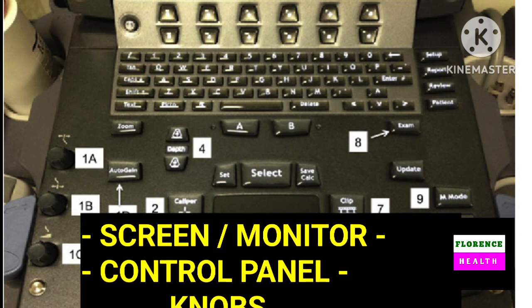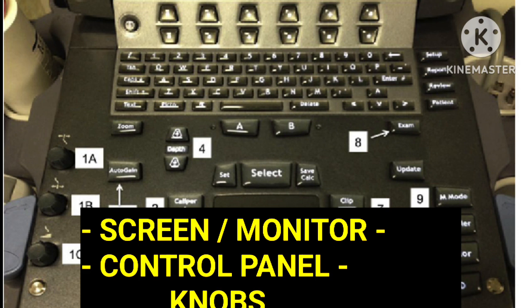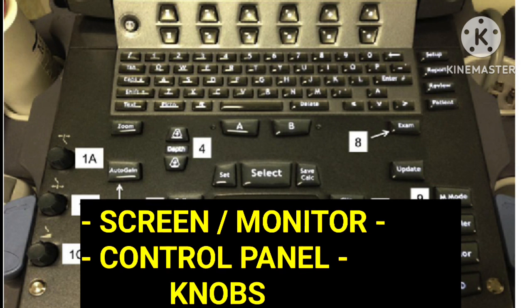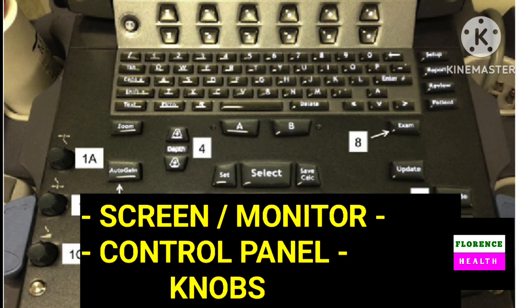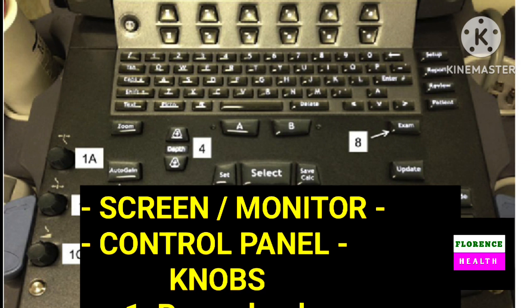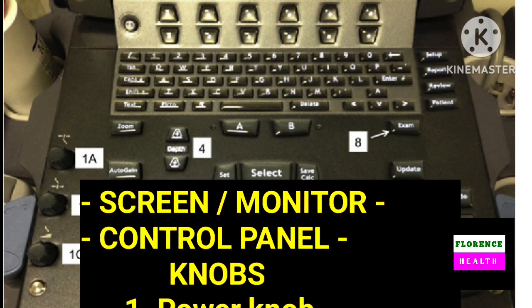First knob is the power knob. It is otherwise called the on or off button of the machine. It is present on the left side top of the machine. By pressing it, the machine will be switched on, and by pressing it again, the machine will be switched off. Second knob is the new patient knob or new patient button. As the name suggests, this button is used for adding a new patient.